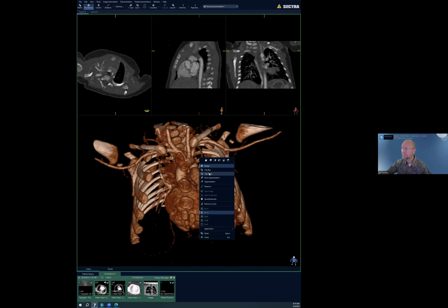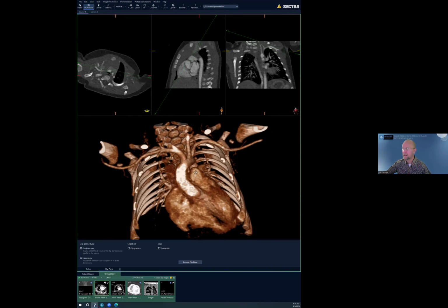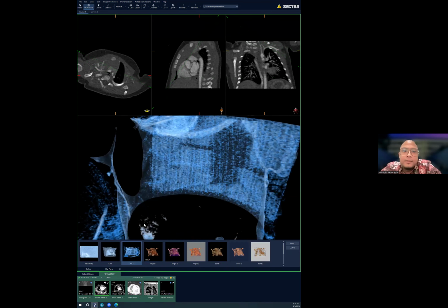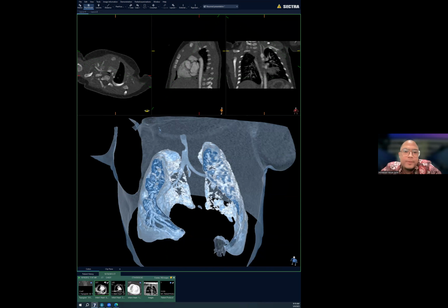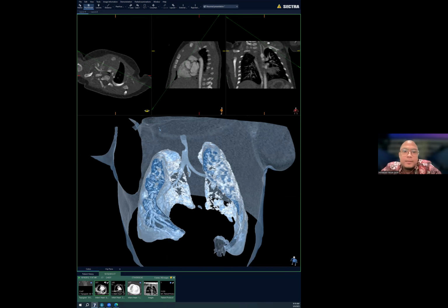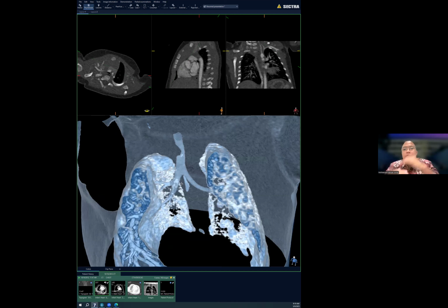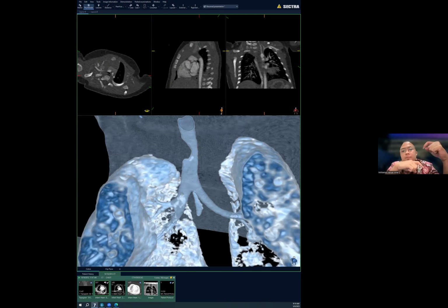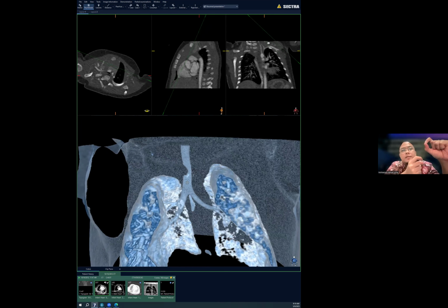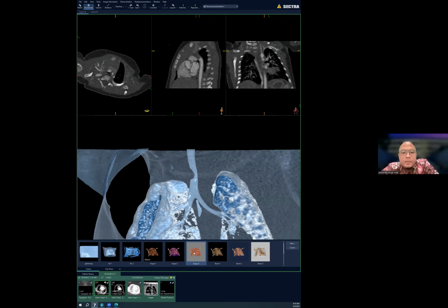I'm not sure. Do you have any other thoughts? Yeah, because I have also experience with not the same but similar, because of the distance of the manubrium and the ascending aorta, it's quite large, so it causes compression to the airway.